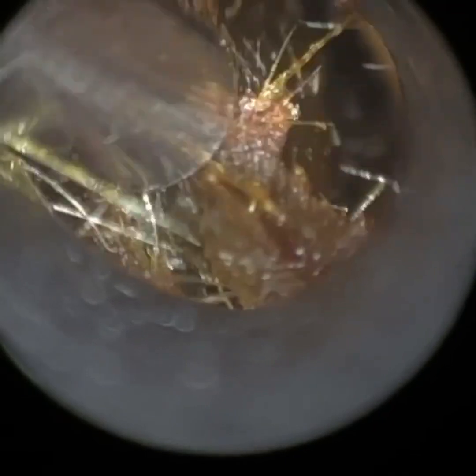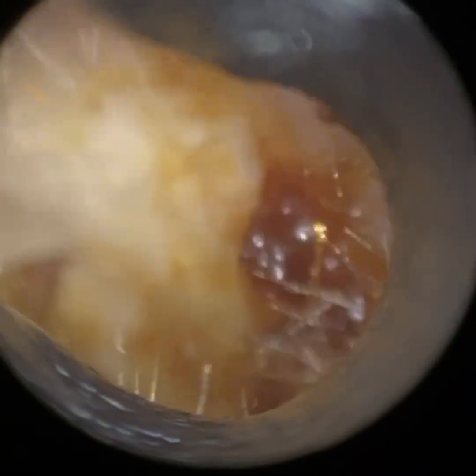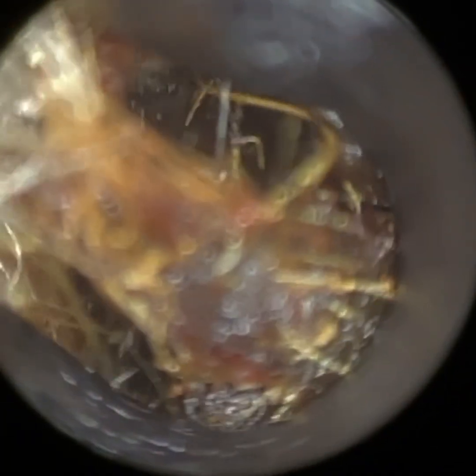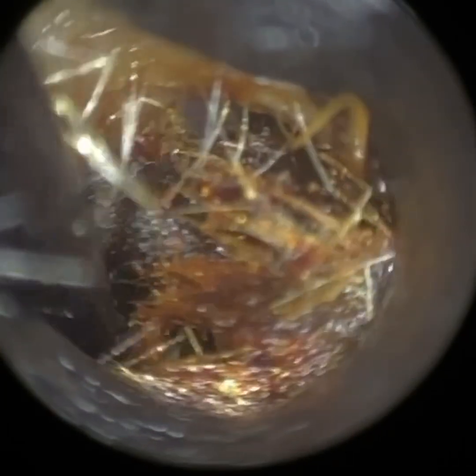Cases like this is probably where some people would struggle using our other device, the iClear Scope. The iClear Scope is an endoscope, and you would have to use the endoscope itself to retract the pinna, retract the ear canal, to widen it in order to gain access and insert the instrument. That just requires a bit more bilateral integration and coordination between both hands, and it can be a bit tricky for some to develop that skill.